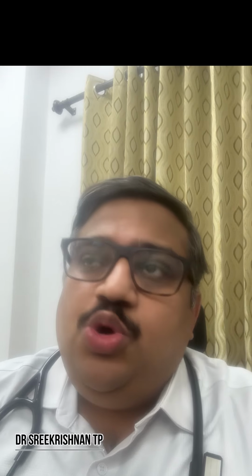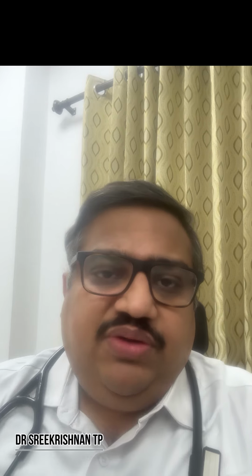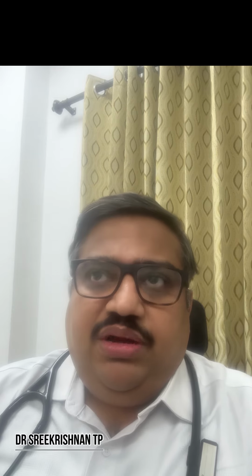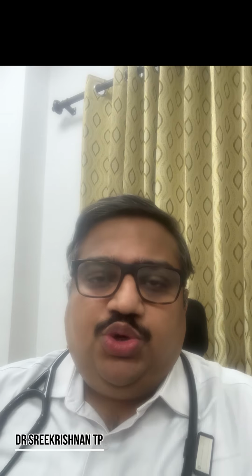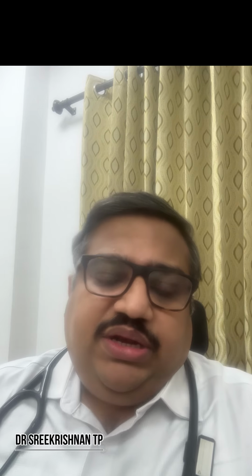So today what we are going to discuss is how to detect an RV myocardial infarction from ECG. You know, right ventricular myocardial infarction. Whenever we say myocardial infarction, it can be infarction to the left ventricle, right ventricle, also the septum. But it is very important that we should know how to detect an RVMI. So how will you detect that in the ECG?